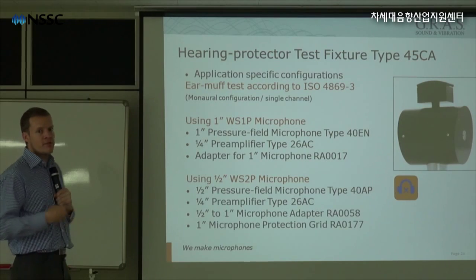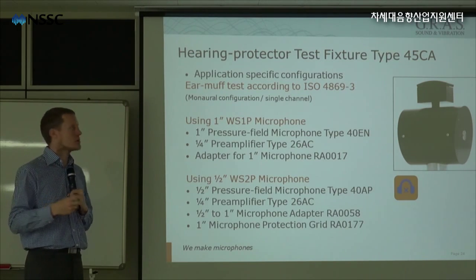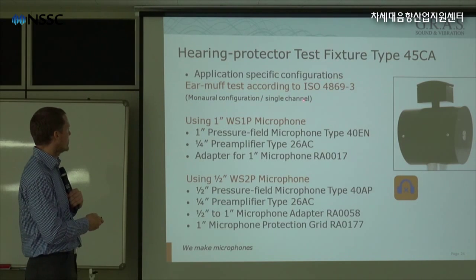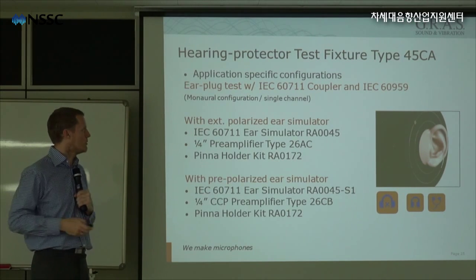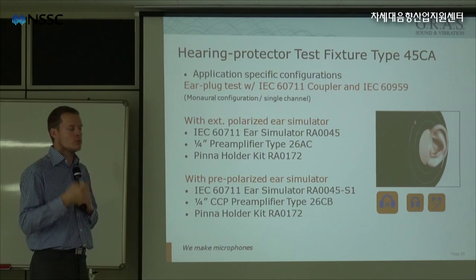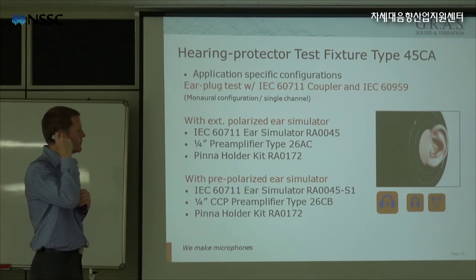We have developed this jig a little bit further than what the standards specify. So we are able to equip it with other kinds of equipment. Like we are able to put a human ear inside the side of the test jig. So this will make it more realistic according to the response and acoustic performance of a human ear.